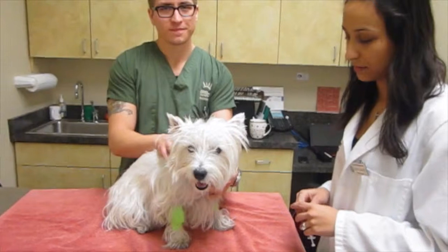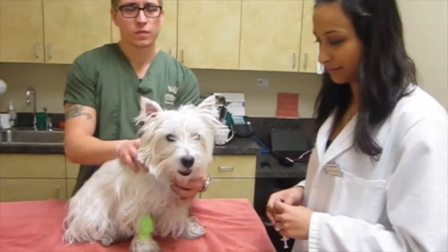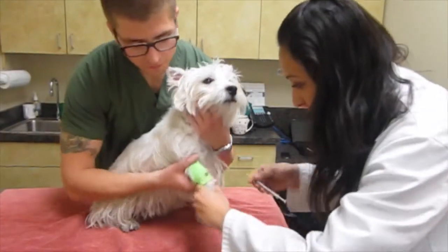This is Zach, one of our technicians at Dermatology for Animals, and this is N.G. Gerges, a senior veterinary student. We're going to give Willow an injection of dexdomitor, which is a very mild sedation, and we'll get her relaxed.